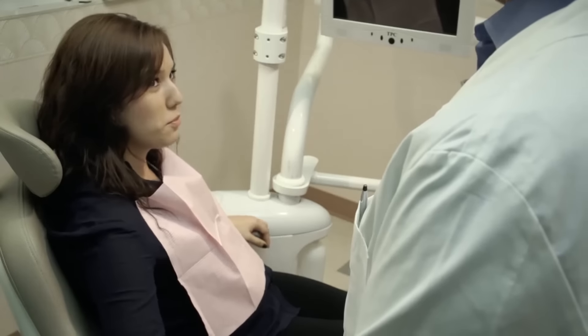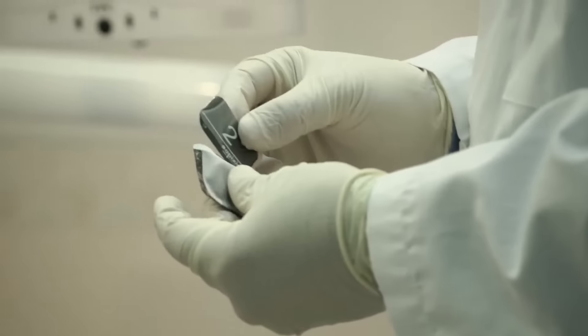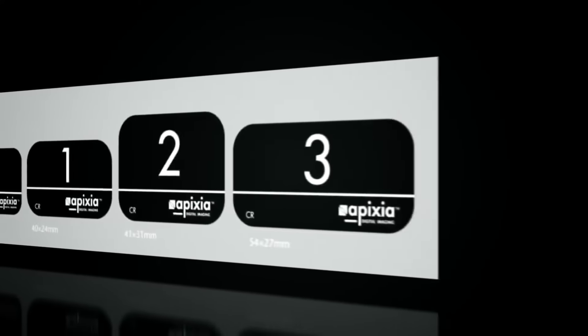Phosphor plates have all the traditional benefits of x-ray film with the speed of high-tech digital radiography. With the wireless Digirex PSP Scanner, there's no need for hazardous and costly film processing chemicals. Patient comfort is assured with thin, flexible plates in multiple sizes.